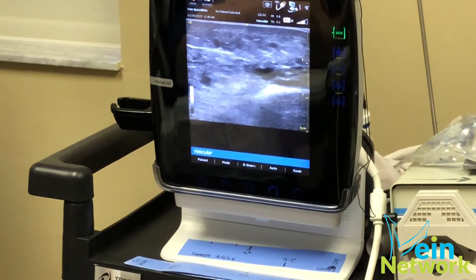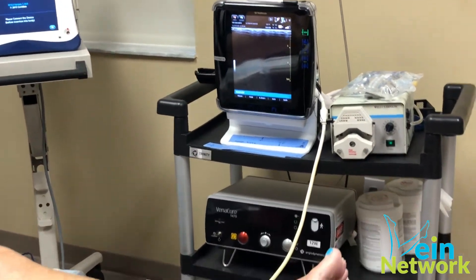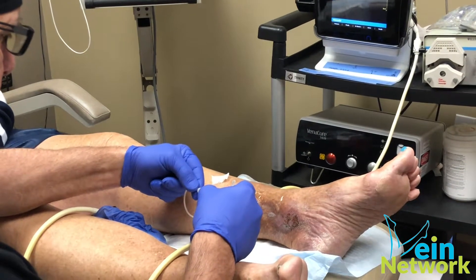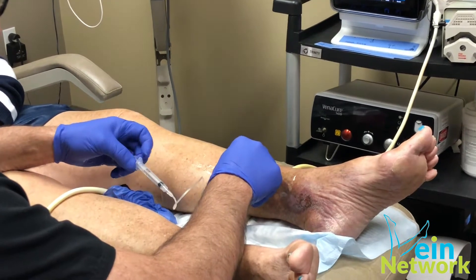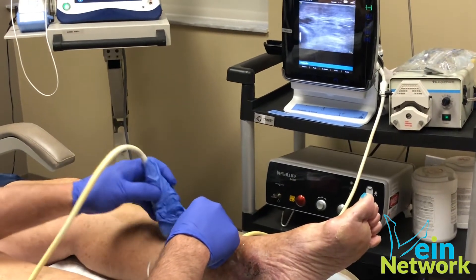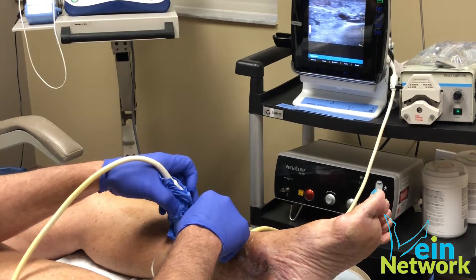You put a needle into the vein right there. Now the needle's in the vein. I'll aspirate it. I'm going to make sure the needle is actually in the vein — it needs to be in it, not just near it.